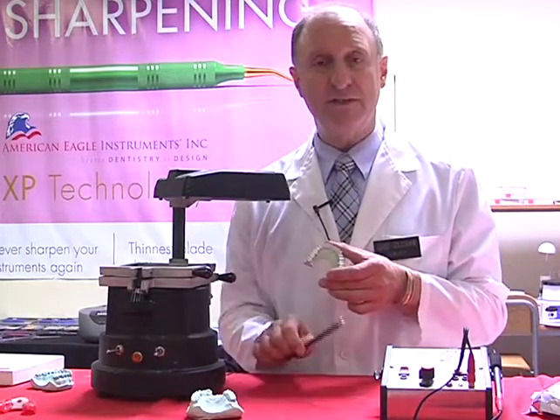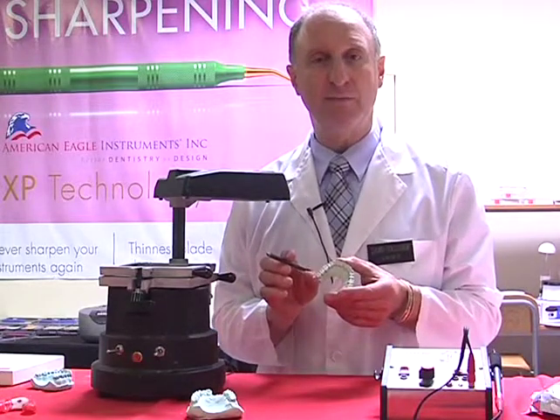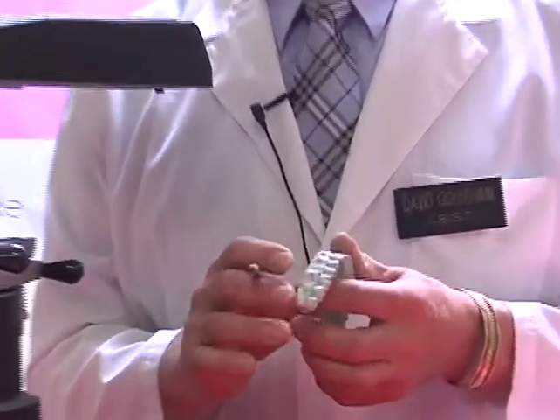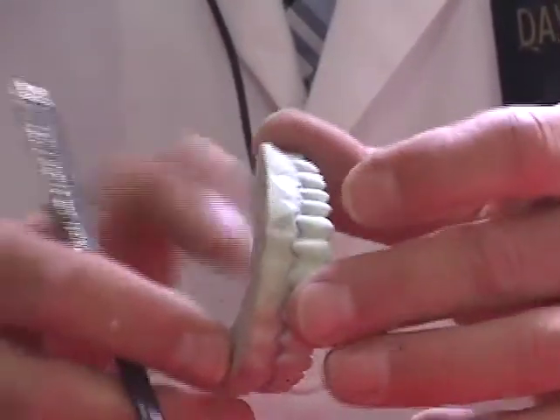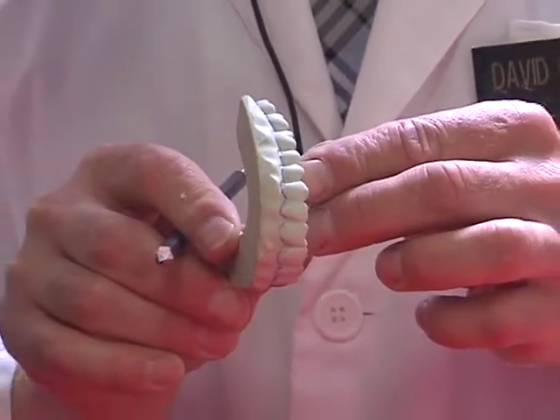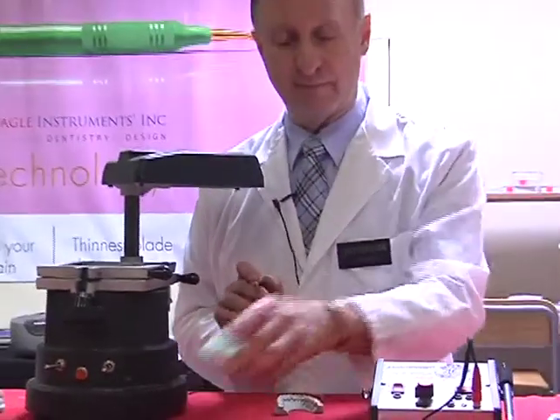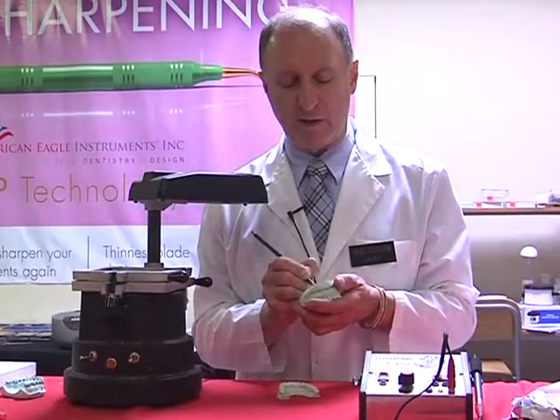Now, I also want to use, in this case, a very special pencil. It's called an indelible pencil. The indelible pencil, by lightly passing it through the gingival sulcus, marks and stains the area. That's important because I want to see that when I'm trimming later on, and I want to know exactly where to trim to. I can do other things with the indelible pencil, such as write the patient's information, the patient's name, on the model.